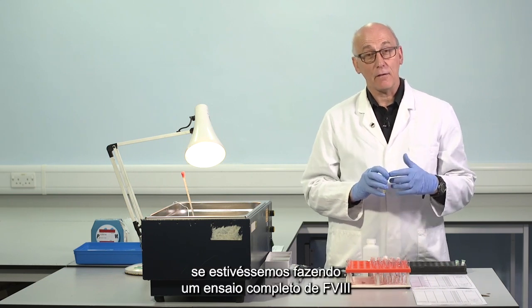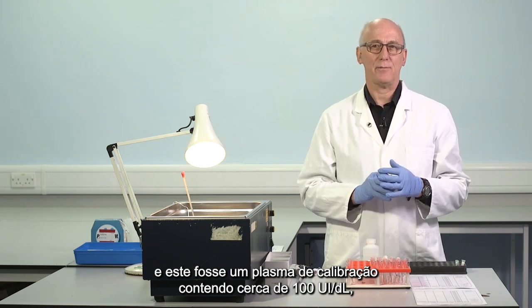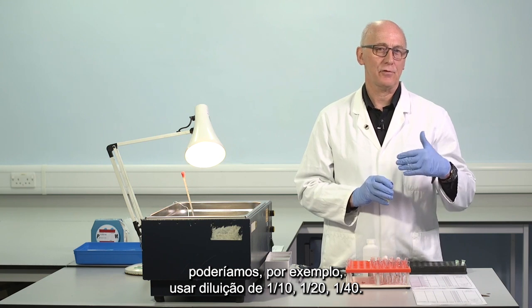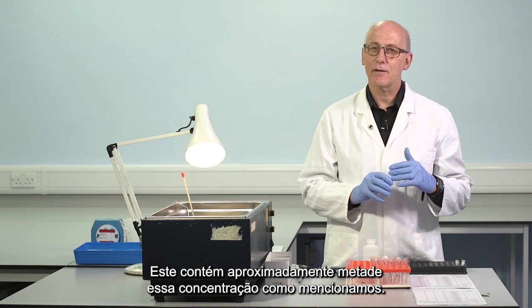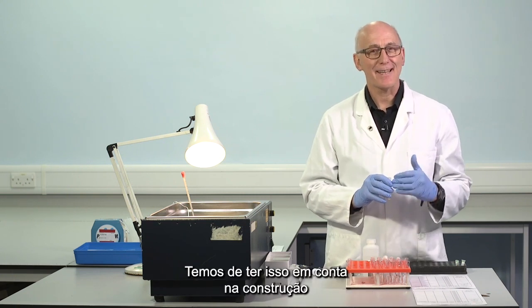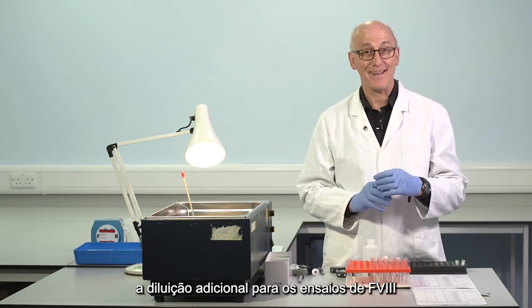If we were making a full factor 8 assay, and this were a calibration plasma containing close to 100, we might, for example, use 1 in 10, 1 in 20, 1 in 40 dilution. This contains approximately half that concentration, as we've mentioned. We need to take that into account in constructing the further dilutions for the factor 8 assay.